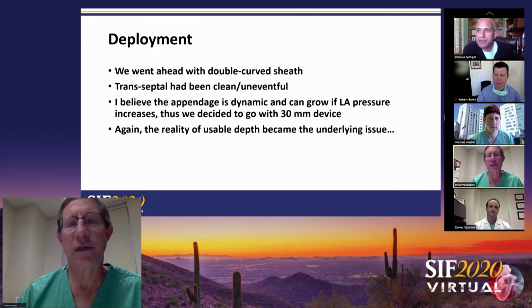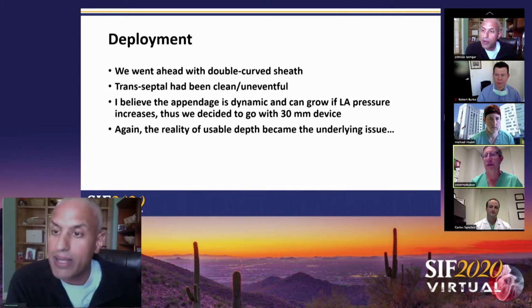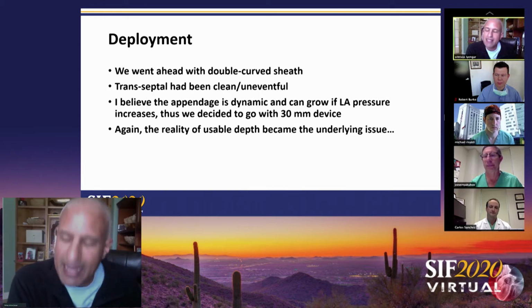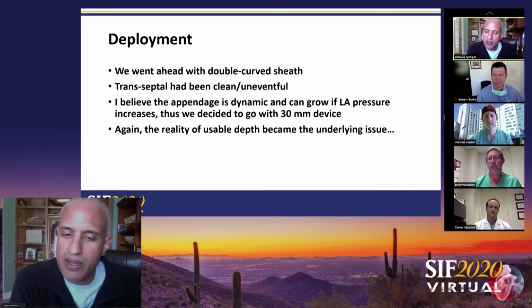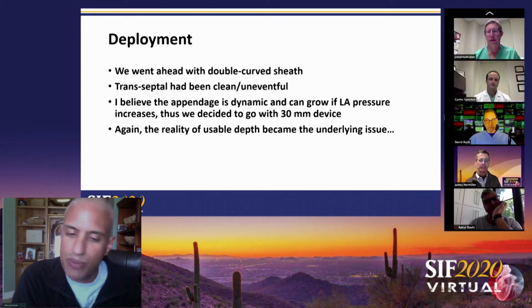Srinivas, after seeing your angiogram, if you didn't have a CT, I would have really wished that you had a CT. Correct. And I did at that time, thinking exactly that same point. It was one of those where, as many of these as we have done, you find yourself relearning sometimes, after a few hundred cases, to say, I should have done this before. And I actually felt the same way. So I think you can always learn something new during these cases.